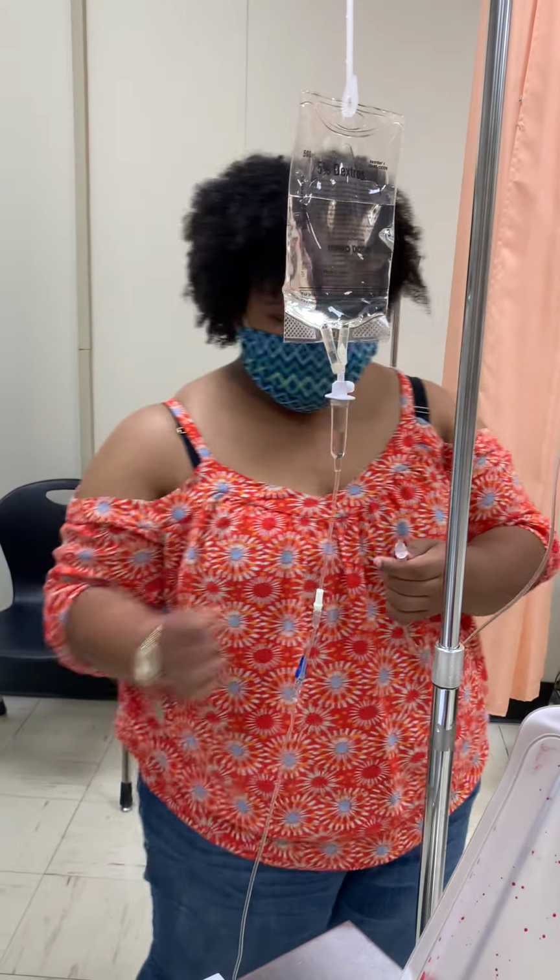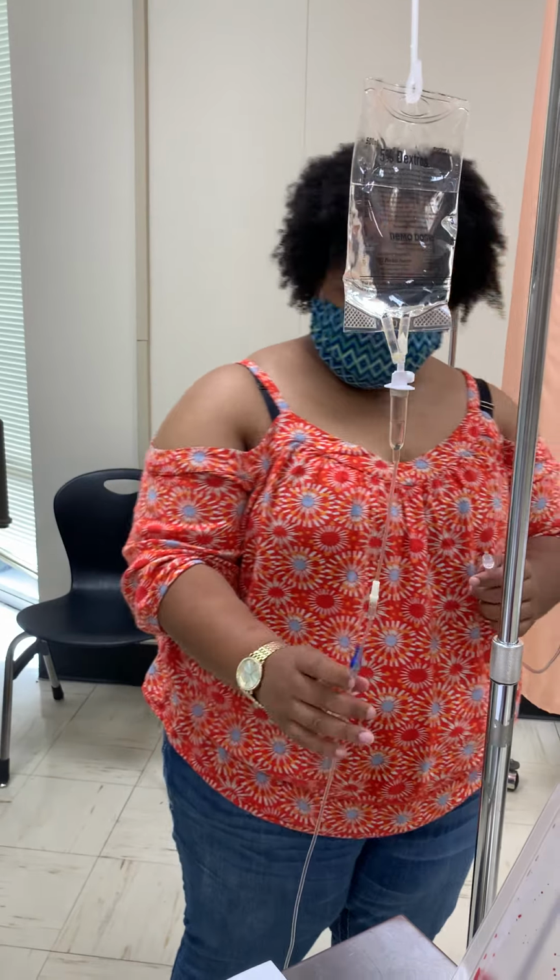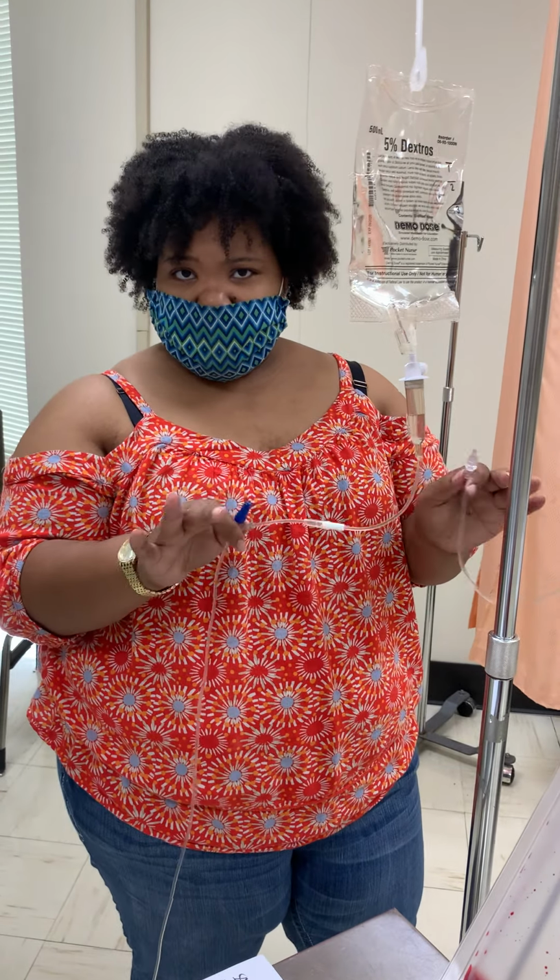Okay, got it off. All right, and so if I touched anything, I know I need to cleanse it with alcohol, okay?